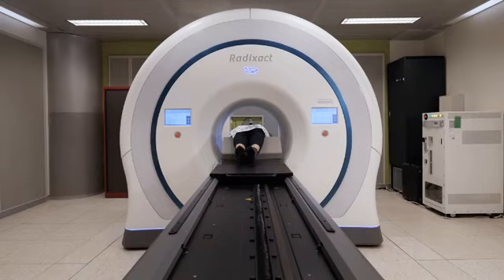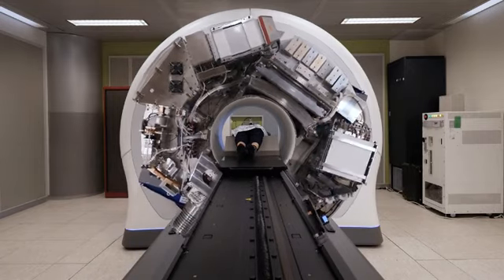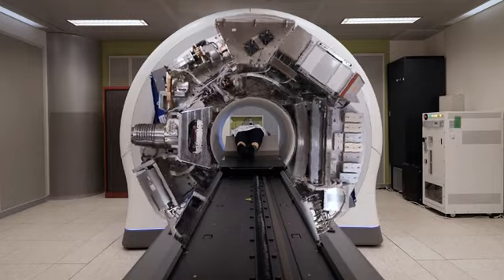There are no oblique angles that you can do. In other words, like I showed with the C-arm, you could come in at different angles by angling the table and the gantry. In this case, it's all just one straight coplanar field. So the gantry rotates as the couch moves in, and here's the equipment inside.